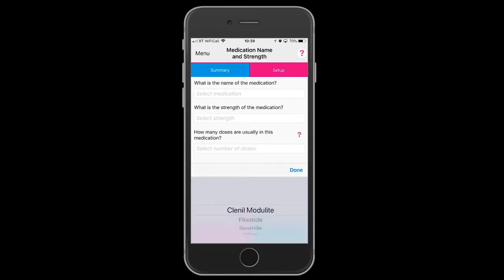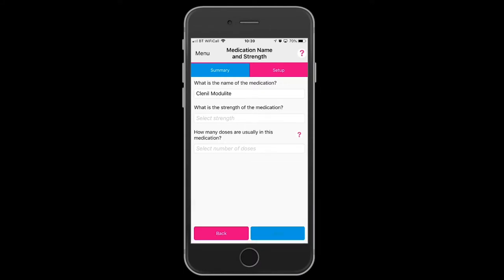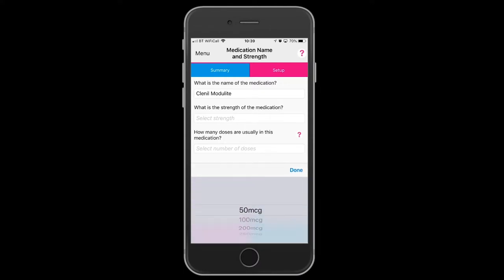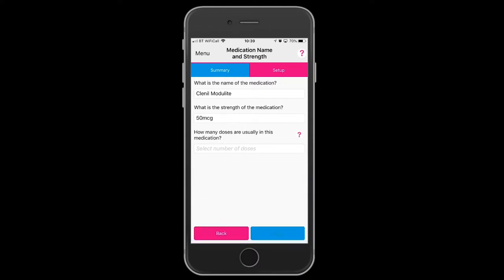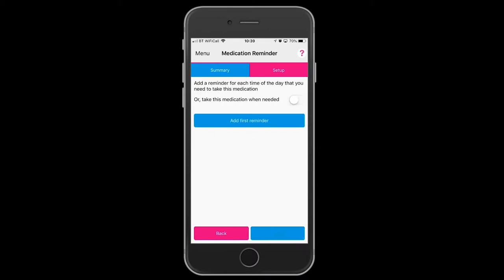Select the medication name. There are pre-configured pMDIs — Clenyl Modulite — and their strengths. There are 200 doses in a 50 mcg. Press next.